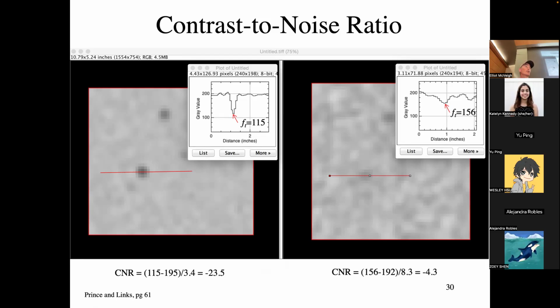Okay, so with a signal to noise of 20, very high confidence in answering the question, is there a black dot there? Radiology questions come in that form. Is there a black dot here? Or is there a metastatic lesion in this liver? So it's a binary output, yes or no. It's a very simple thing. Here, we're going to say yes with super confidence. We're going to be right 99.99% of the time.